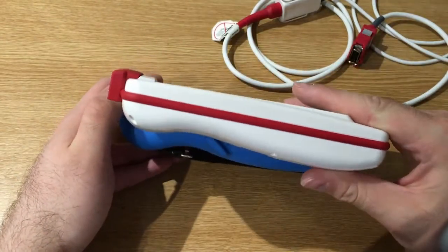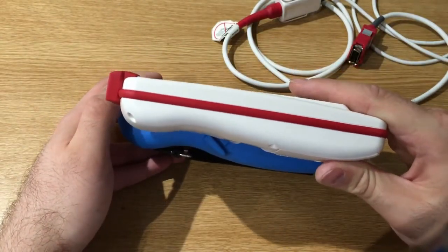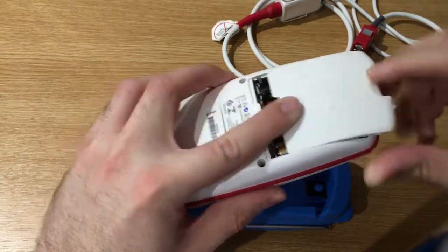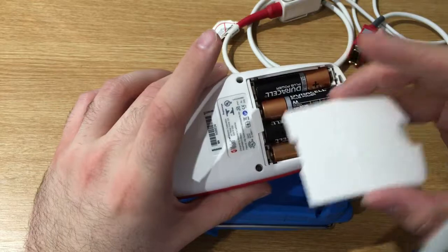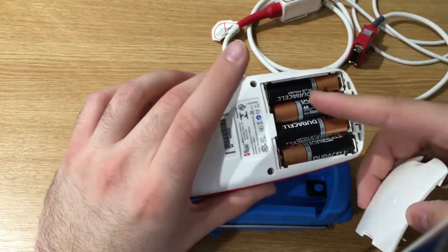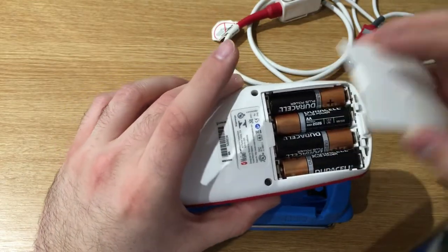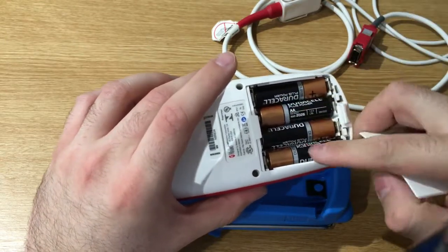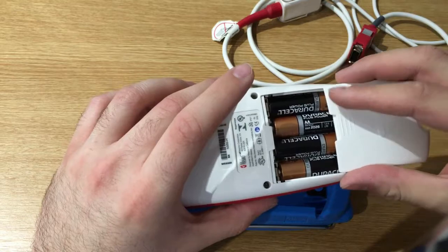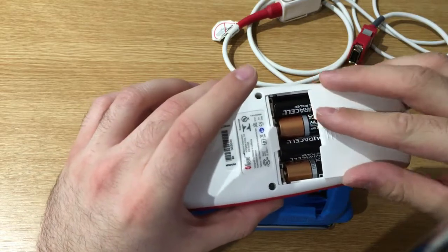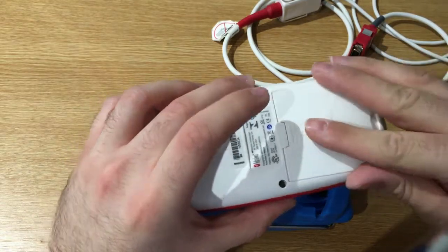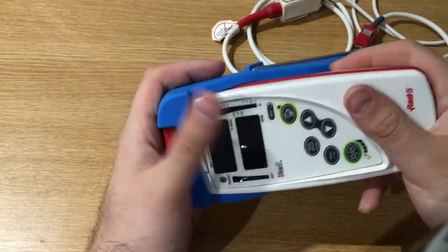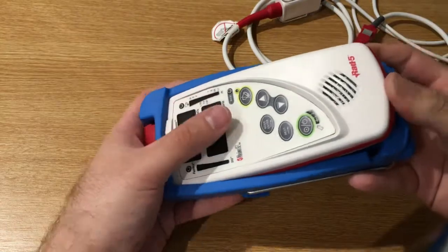On the back there is this battery cover. We can just press this button and slide it, and here there is the battery, with four AA batteries, so no proprietary battery. This is another huge plus. They are pretty easy to find on the market, pretty easy to replace. It's quite easy to put it back in the cover as well.